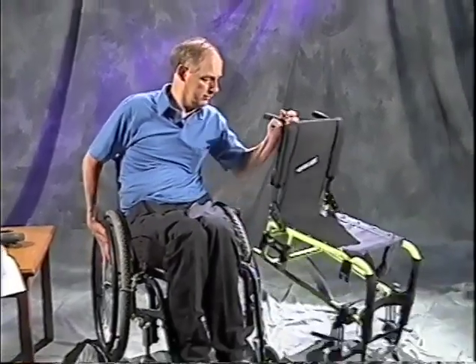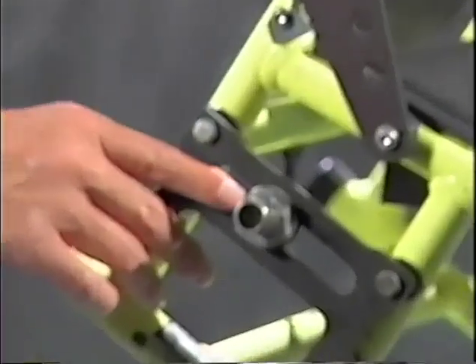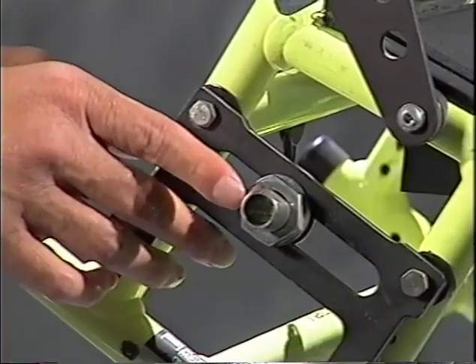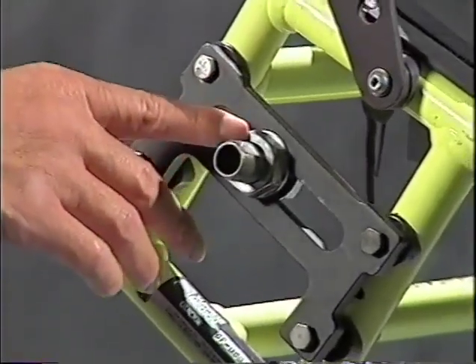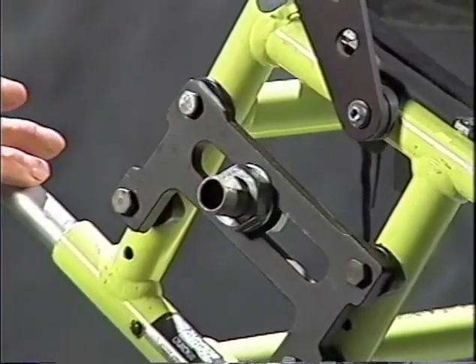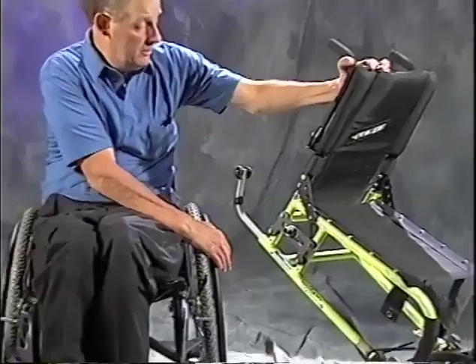And then if you need to adjust the chair, you can simply do that by moving the axle mount. This large 1 1/8-inch bolt can be loosened up, and this axle sleeve can be threaded in or out to make the chair narrower or wider as you go. So you can fine-tune the width of your chair so that it's not rubbing on your sides. So if you gain a little weight, you can change it, and if you lose a little weight, you can change it back again. Okay?